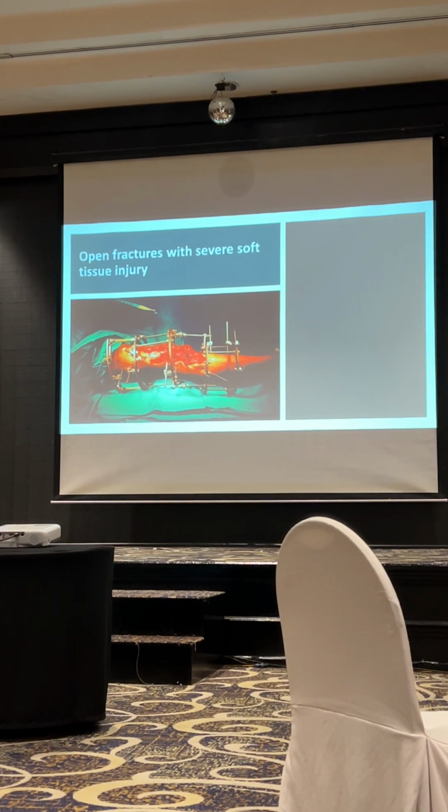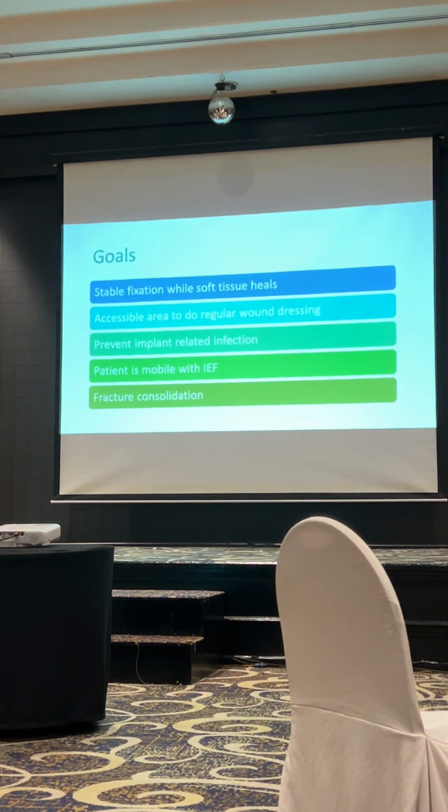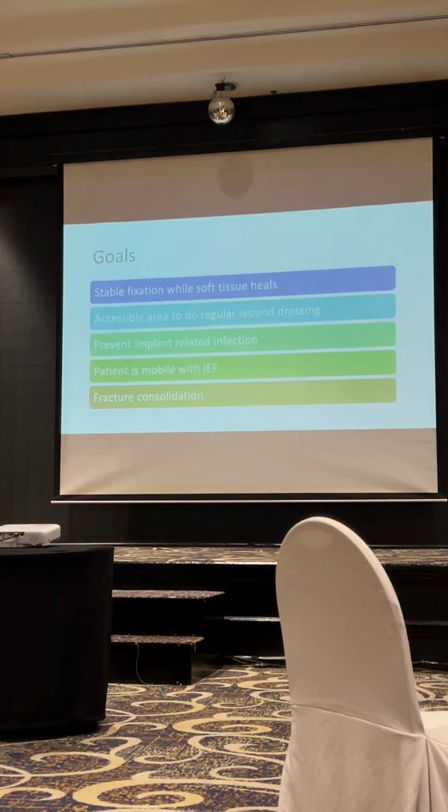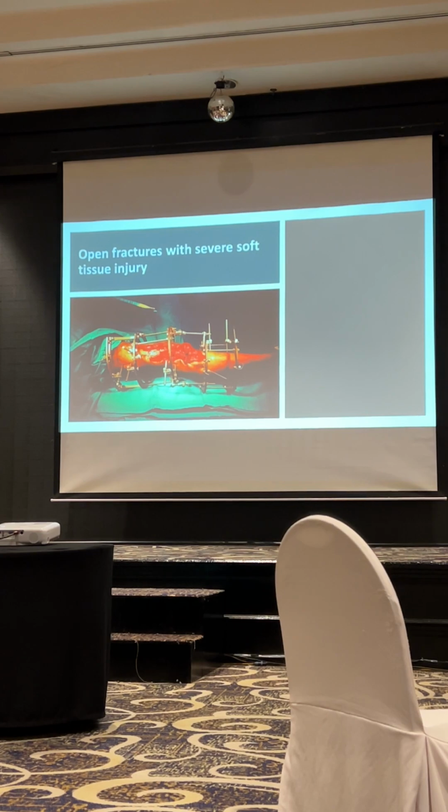So the next condition where you will apply Elizarov is open fracture with severe soft tissue injury. I think you will see this almost always in your practice. Open fracture with severe tissue loss. Sometimes the knee is open, so you apply Elizarov.